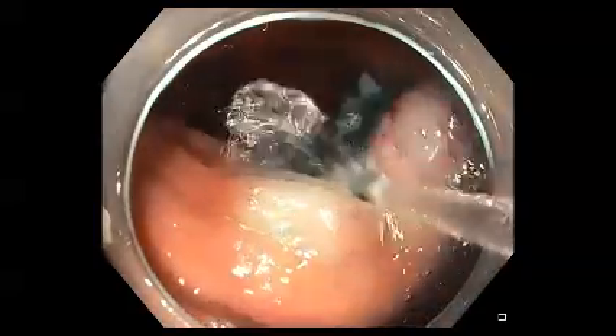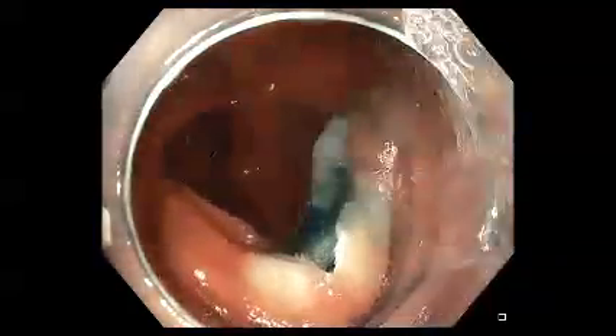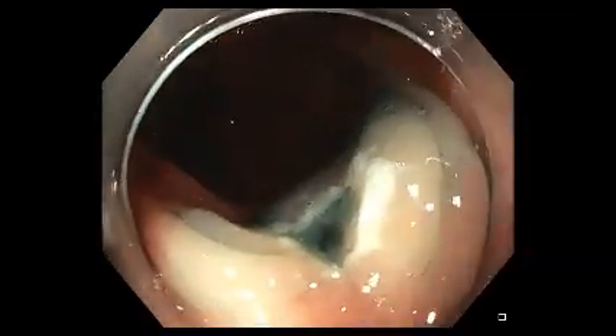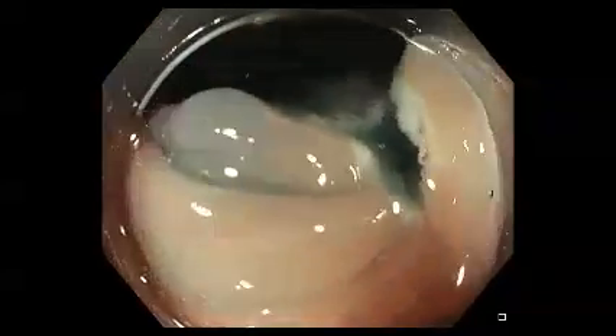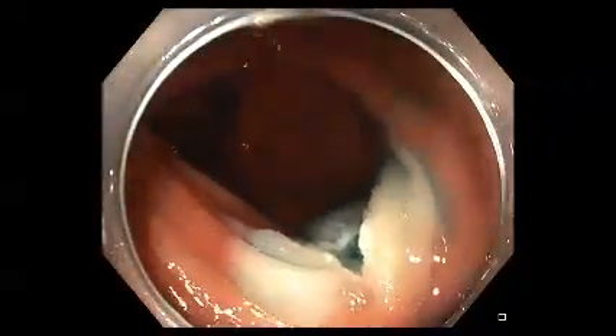The lesion is then resected with either a blended current, or in many cases we now use a pulse cut or endo cut mode to minimize cautery damage to the margins and the deep base.